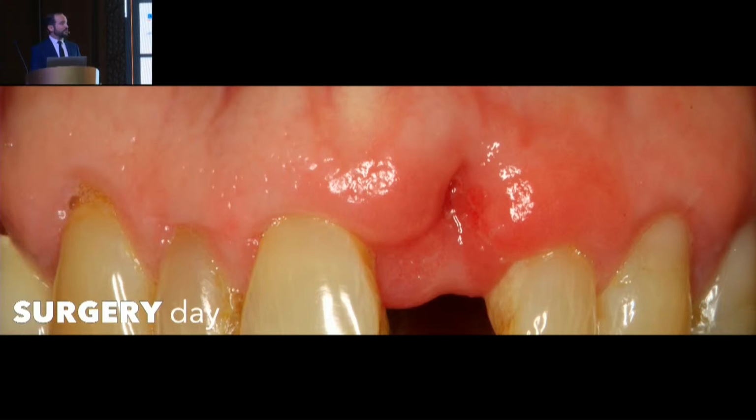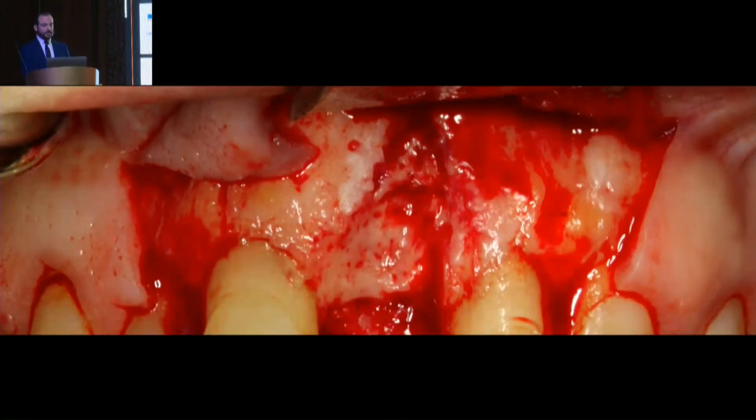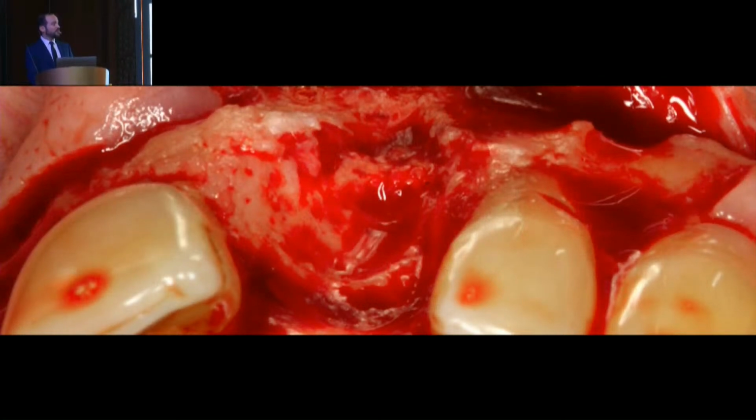And when we have the soft tissue healed, we get rid of that little bit of exudate, we proceed to the surgery. And this is the view that we have as soon as we have, once again, our full thickness mucoperiosteal flap. We can see that tremendous defect. That probably is the exact position where we had the root of that central incisor. When we see an occlusal view, we can once again see the defect.